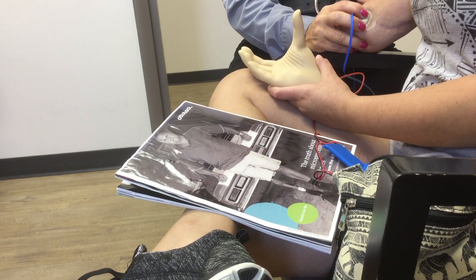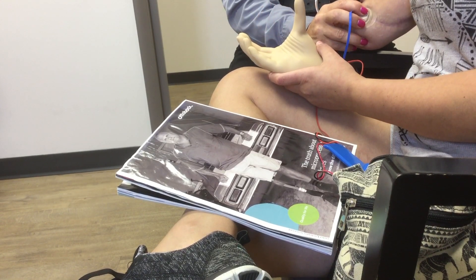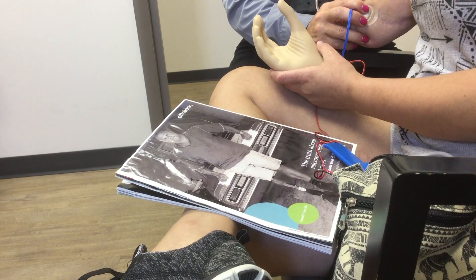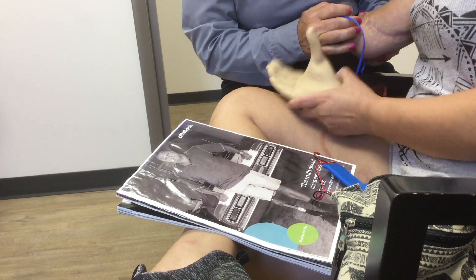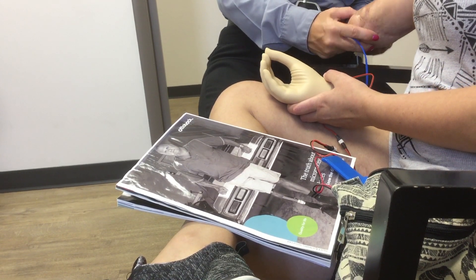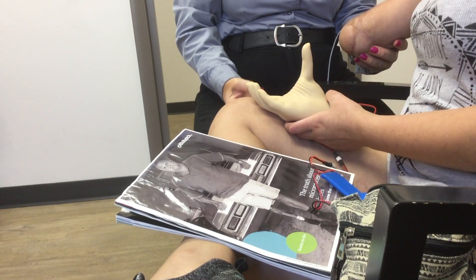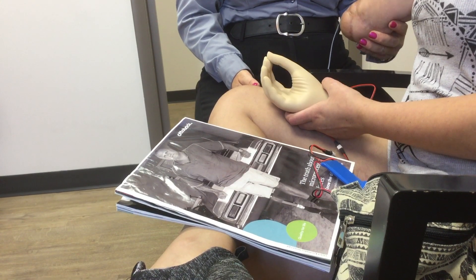That's when I move my elbow down, actually. Oh, that's cool. So you're definitely in that little nook right here, which is what I have in your socket. Okay. And in this one, right?